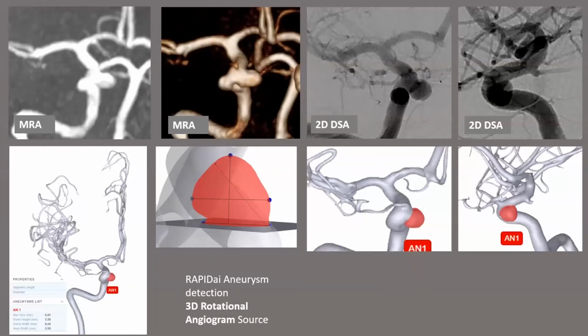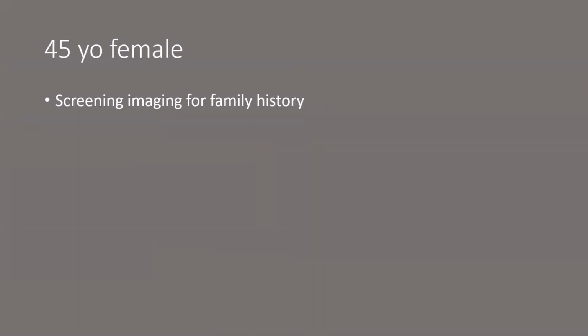Here's a case that was along the skull base, a medially projecting cavernous aneurysm. You can see again the measurements. This one was run off of a 3D rotational angiogram. Again, you can manipulate it, with really nice clear anatomy, and it shows that aneurysm quite nicely.